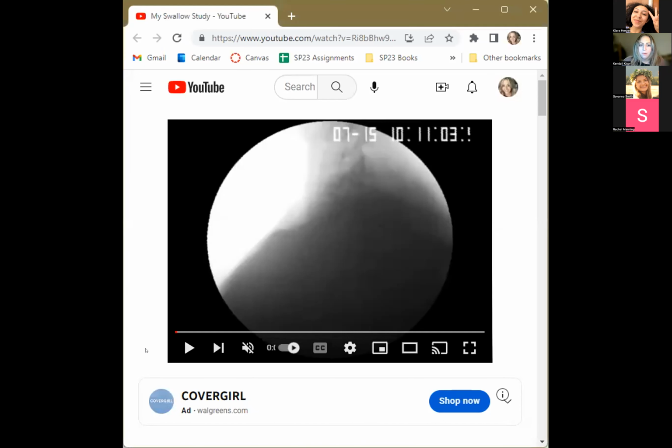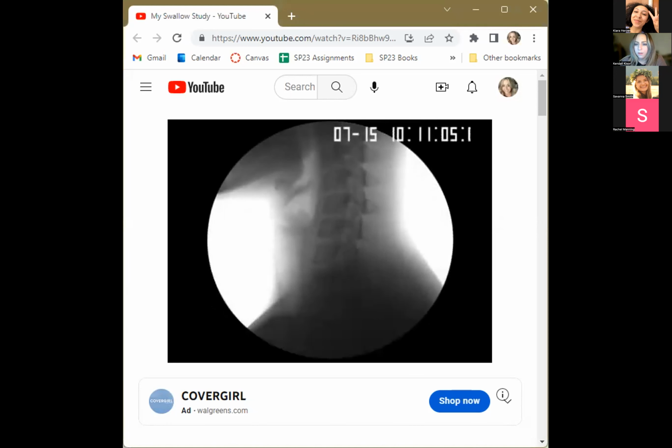Okay, hi guys. My name is Kendall, and we're going to go over Rachel's modified barium swallow study.